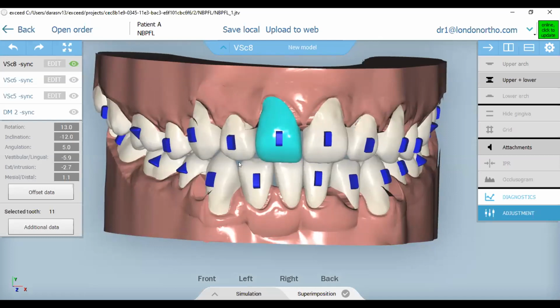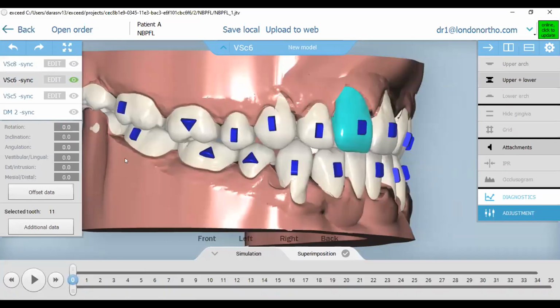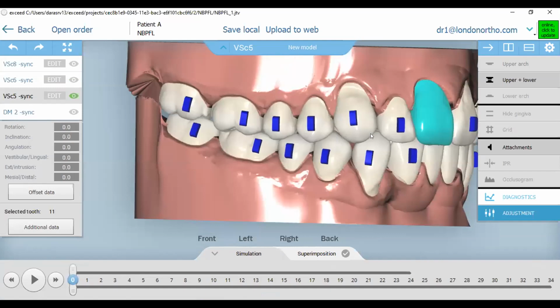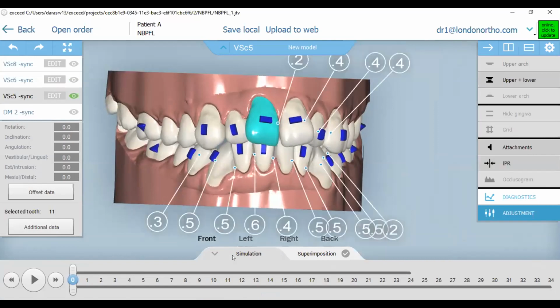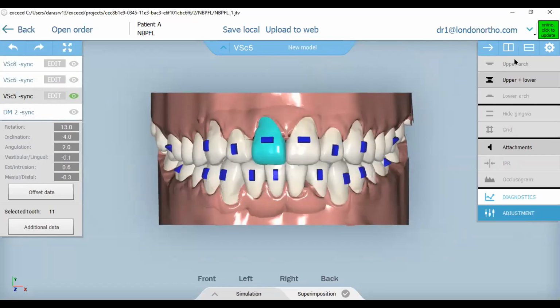But I want to show the patient why I want to do this. So I can tell the technician, okay, show me three cases, and they will actually send you those three cases at the same time. One case is with extractions of premolars. I can tell the technician, show me a case of distalization of both arches. In here, I'm going to treat that with mini implants, like I mentioned, or show me a case just with IPR, for example, because I don't want to do this amount of IPR on a patient, but it's a way of explaining to the patient why I'm choosing that option. So this is really advantageous for me, to be able to have three different possibilities at the same time to explain to the patient why we are doing that.